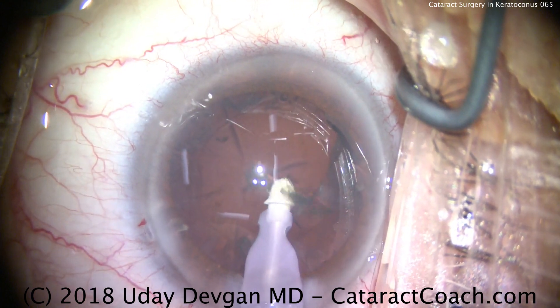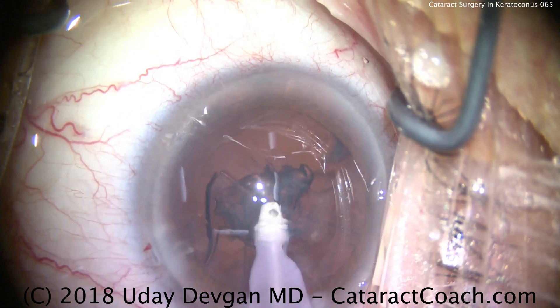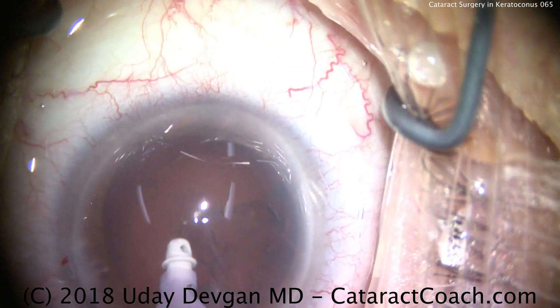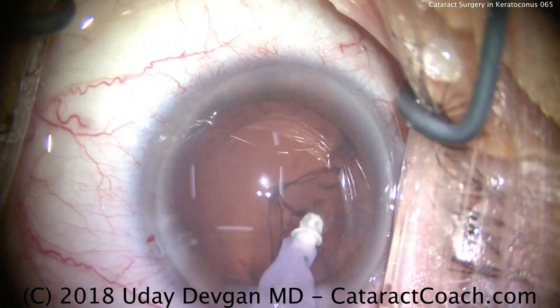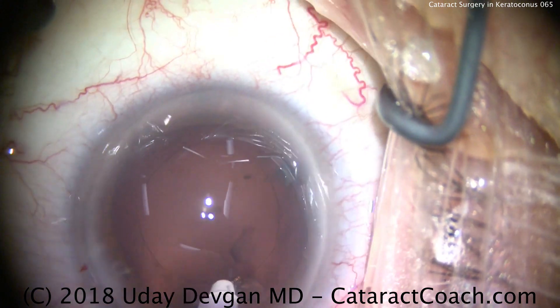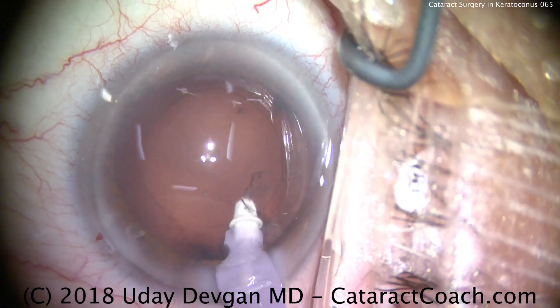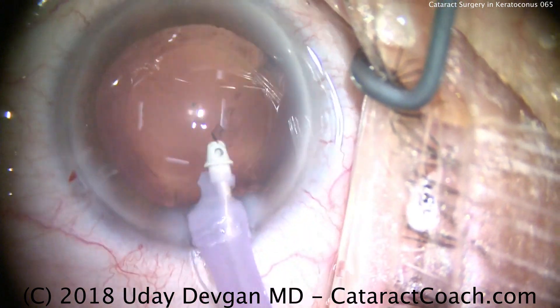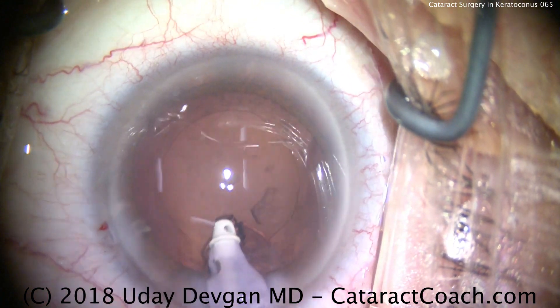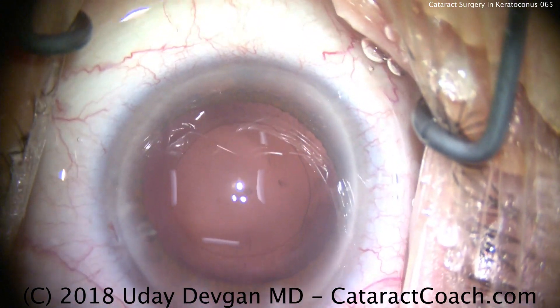For lens choice, I encourage you to use a monofocal lens — and even avoid a toric lens — because the degree of astigmatism is very high in these eyes and it is irregular. If you have a toric lens in the eye and the patient is wearing a standard rigid or hard contact lens outside the eye, that hard contact lens will neutralize the corneal astigmatism to a large degree, and now you've unmasked the lenticular astigmatism induced by the toric IOL. That's why we go non-toric.